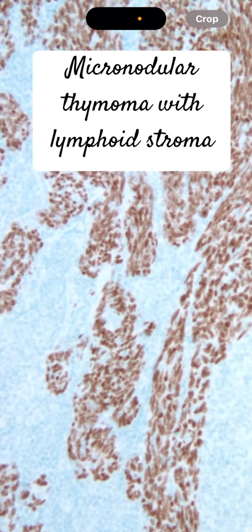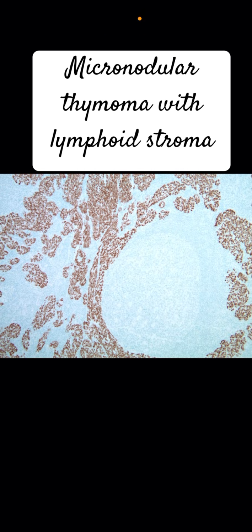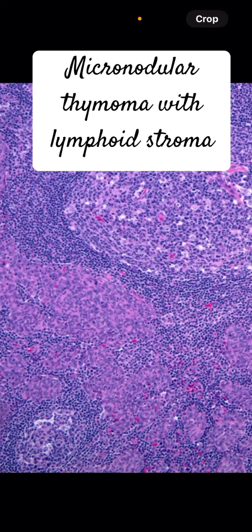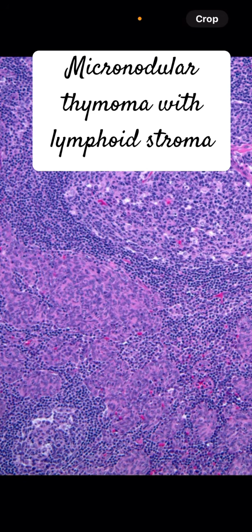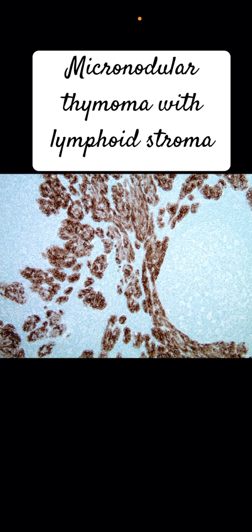See, the germinal center is spared. And again, here you see this combination of thymoma cells on the left-hand side and then the germinal center over here. Here's a keratin stain. And like I told you in previous videos, the neoplastic element in thymomas is always epithelial. So there must be an epithelial proliferation that distorts the architecture of the normal thymus, does not look like normal thymus. And here you get the B cell hyperplasia component.